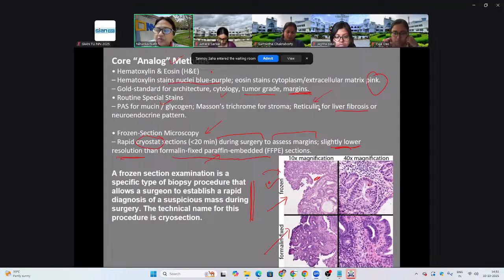These are columnar epithelial cells. They're fairly big, and you can see that they're columnar epithelial cells here. Also columnar epithelial cells here. In some situations, all of these have beautiful cytoplasm. You see that you have a nucleus, you have beautiful cytoplasm, and you have this duct.